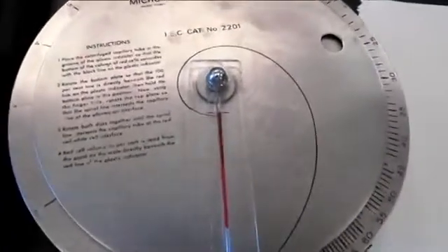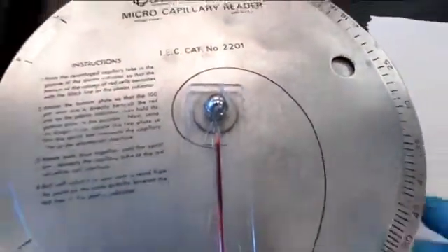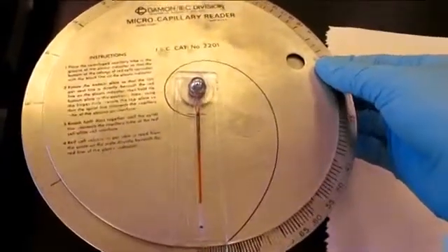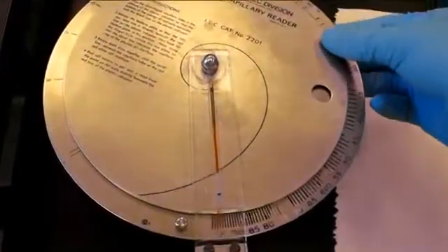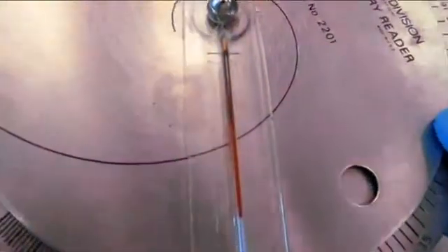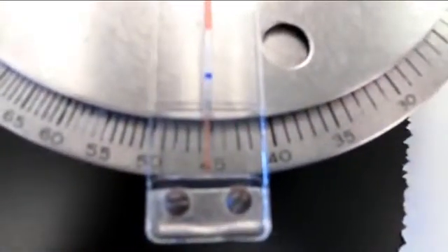Now you are able to determine the hematocrit. Align the top of the clay with the horizontal line as shown. Next, rotate the inner circle until it reaches the top plasma layer. Now rotate the outer circle until it is aligned with the buffy coat. The hematocrit should be indicated on the numbers below.